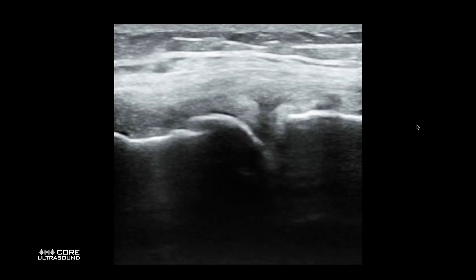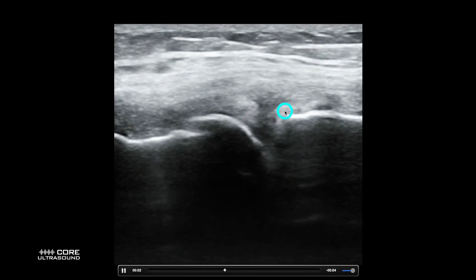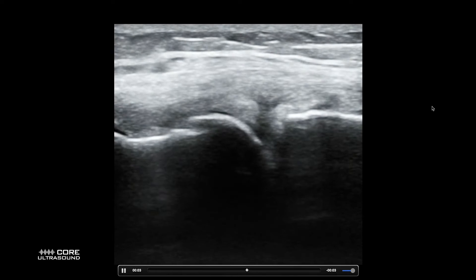This is an example of a meniscal injury. This right here is the meniscus — this whole area right here. You can see that there's a chunk there, another chunk there, and then we have some black stuff going right through the middle of it. This is what a meniscal tear looks like — it's a pretty good-sized one, actually.